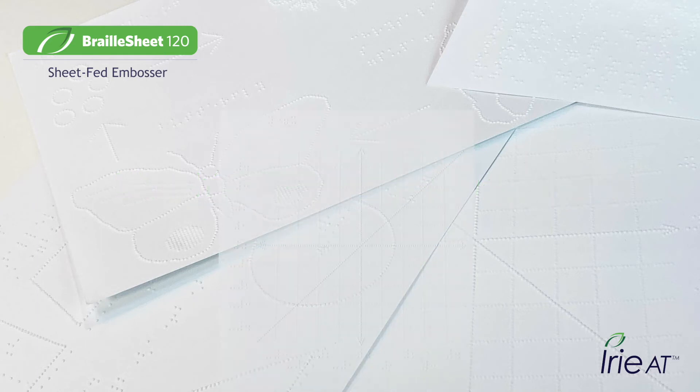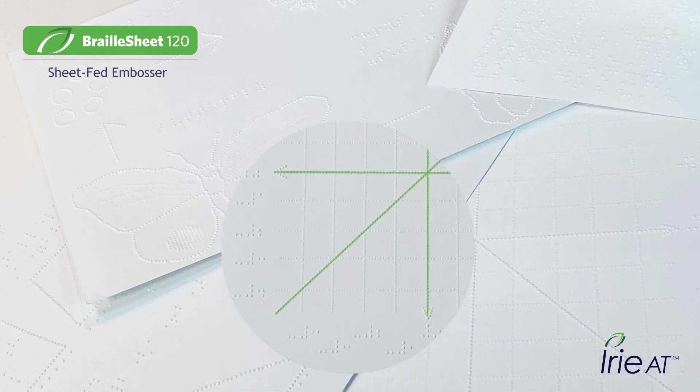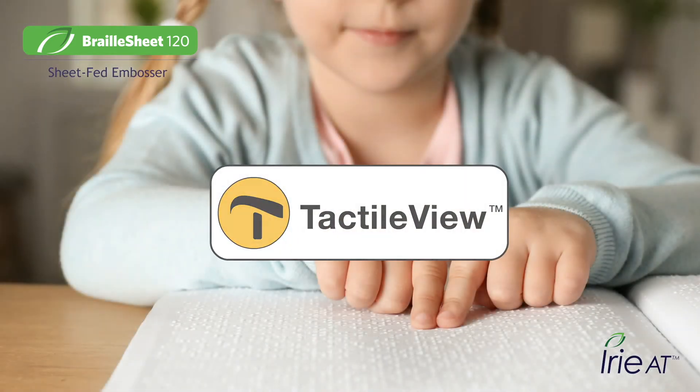Create amazing ultra-high-resolution tactile graphics with smooth curves and textures. Take advantage of Braille Sheet's eight-dot printing ability for complex shapes like graphs — get strong graph lines and axes while your gridlines remain subtle. Braille Sheet comes with a free license of TactileView, tactile graphics design software, a key component to a blind student's STEM education.